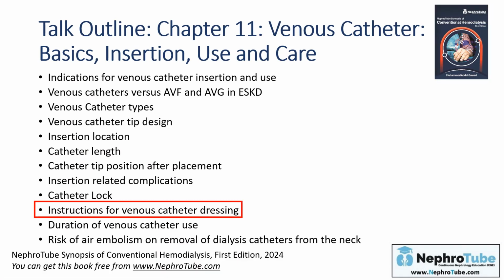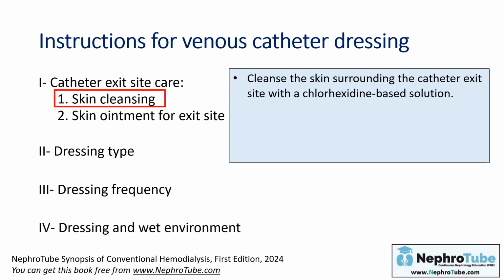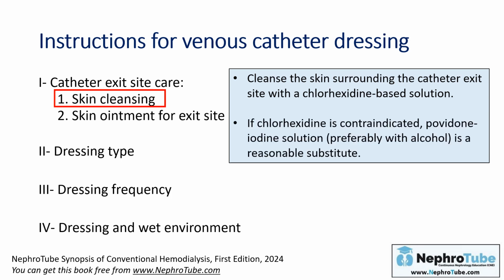Important points related to catheter dressing. First, about catheter exit site care, we will mention in the next lecture that there is what is called exit site infection, and this is very common. So exit site care is very important, starting by skin cleansing. Skin cleansing should be done at the end of every hemodialysis session. Cleanse the skin surrounding the catheter exit site with chlorhexidine, and if there is allergy from chlorhexidine, povidone iodine can be used.